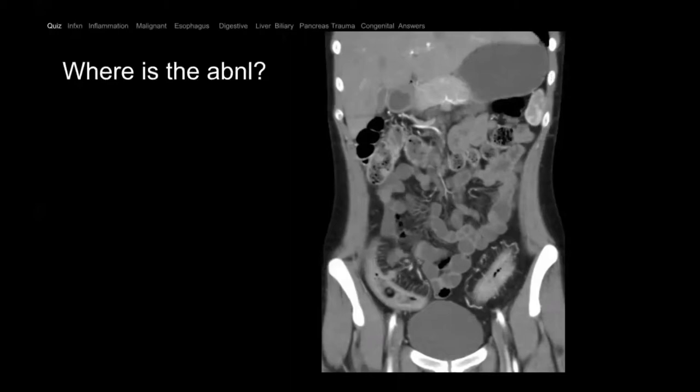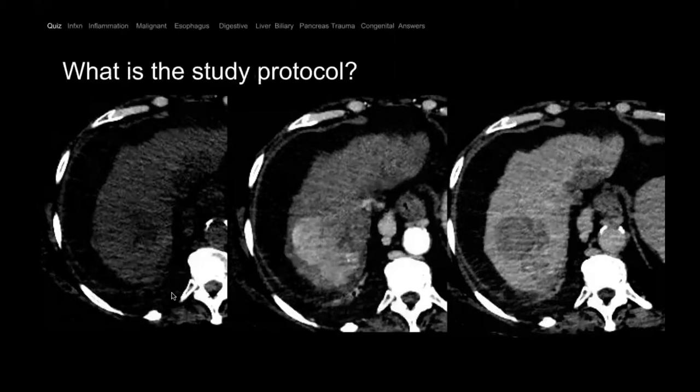Young patient with abdominal pain — which segment of the small bowel is abnormal? The jejunum, the ileum, the duodenum, or all of it? Not sure — that's reasonable. What study is this?